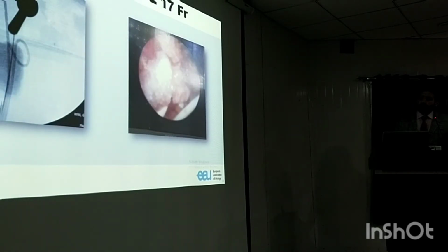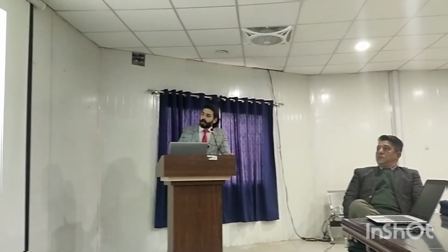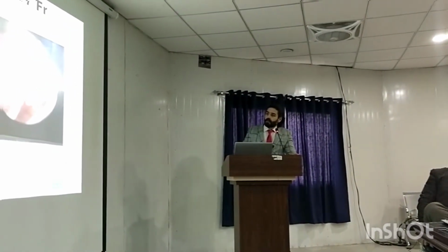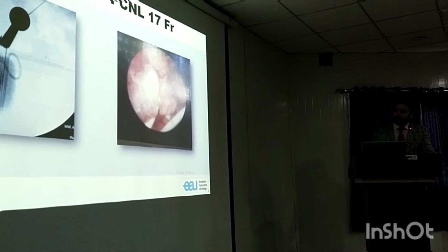So in this picture you can see the sheath inside the renal calicial system, a guide wire and ureteric catheter, and complete clearance of stone on the left side of the picture, and endoscopic view of stone and partial view of stent as well.